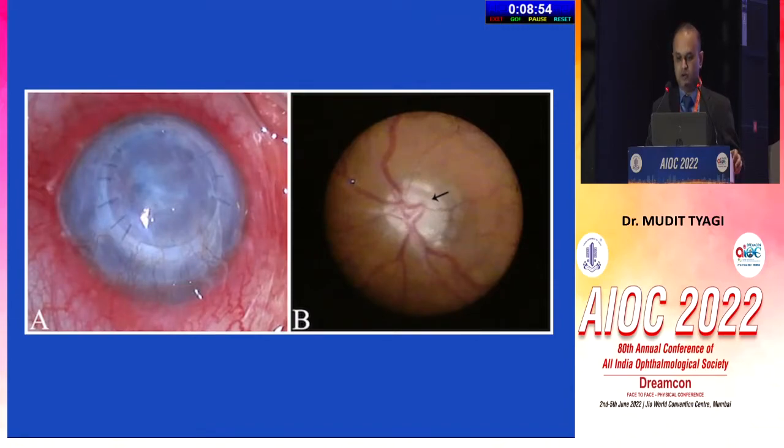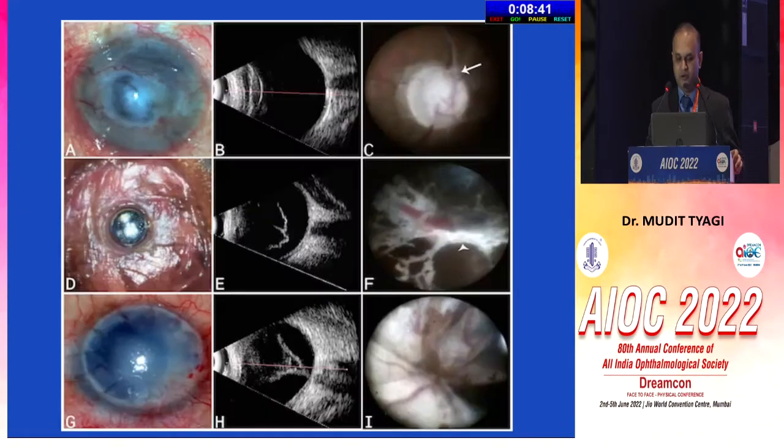This is how a diagnostic endoscopy setup helps us. It allows us to assess the retina as well as the optic disc and can help in better prognostication in these cases where a conventional ultrasound probably may not be much helpful. So these were some of the other images. This is a patient with a corneal scar, where a B scan does reveal an attached retina. If you look inside, you see an absolutely glaucomatous optic disc with sclerosed vessels. This is not an eye which is likely to benefit from any further intervention.